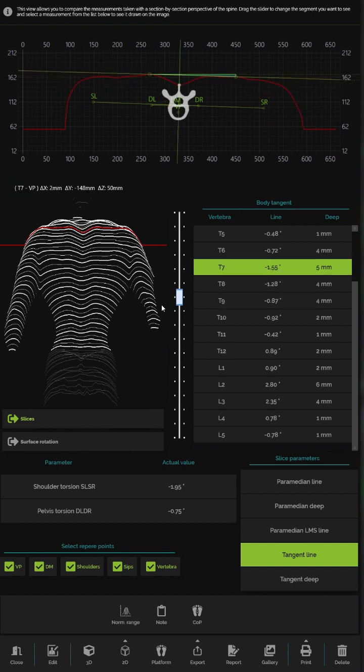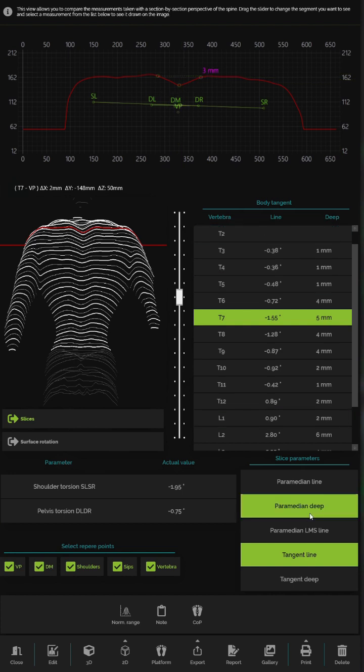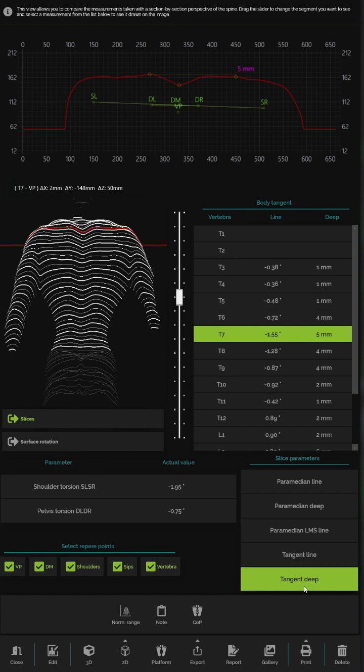So you can see that his shoulders and pelvis are relatively level, but there is a small degree of rotation between that. And that's going to be creating a lot of pressure within his spine on a rotational component. You can measure various different things, or look at his center of gravity in relation to something that interests you on one side in particular.